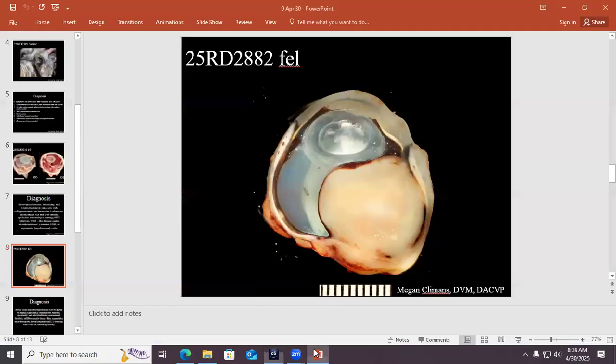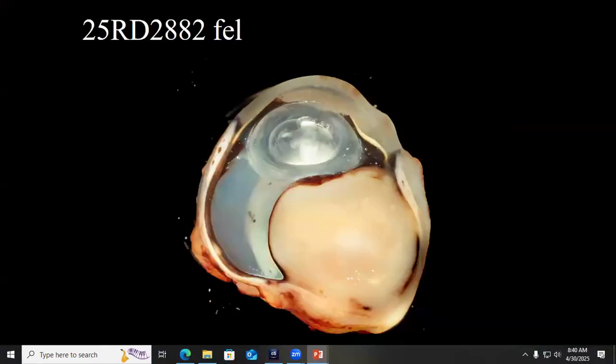Wait. Kelsey says in the gross you can see the finger. Like there? Right, yep. Oh, fingerprints of a gross examiner. The gross examiner was here. All right. It's called digital pathology.